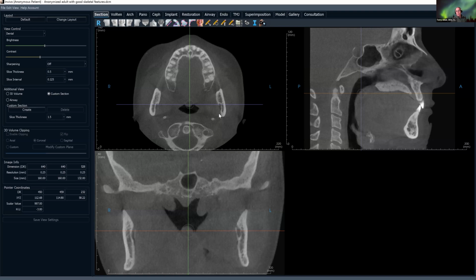They are calcifications of this lymphoid tissue in the tonsils, and so they're not all that uncommon. If you're not familiar with the anatomy and the height of the oropharynx, it's easy to confuse them with carotid artery calcifications, which was one of the five, so that's two. The carotid artery calcifications are typically going to be in, although I've seen a little bit higher and maybe a little bit lower, maybe the C4, C5 range, right in there. So you want to be able to distinguish those.